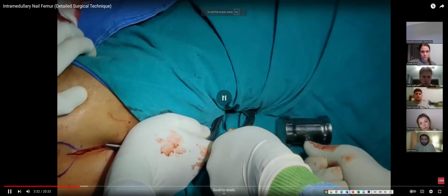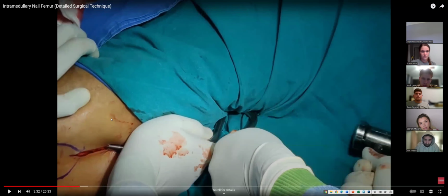So when you are tapping, this is the pelvis, this is the abdomen, and this handle is pushing over the flank of the patient. And you see the skin is under tension here. The femoral bone starts here and ends on the other side. So you see, it's very difficult.